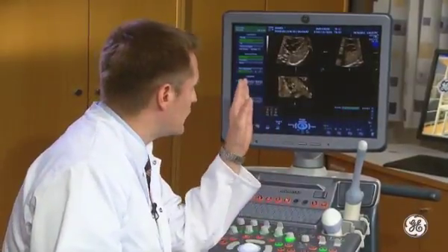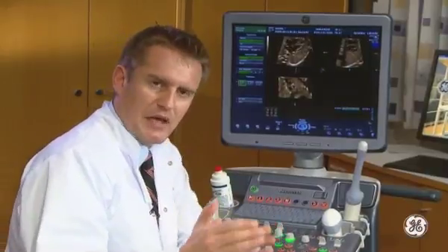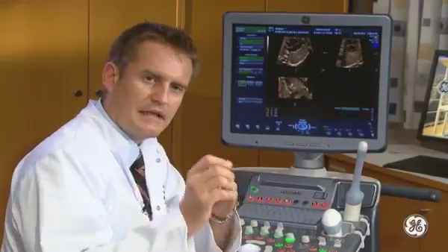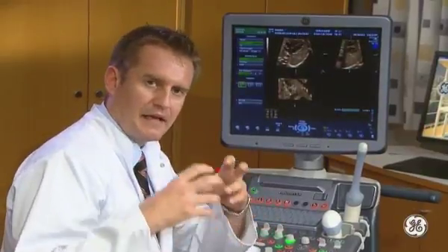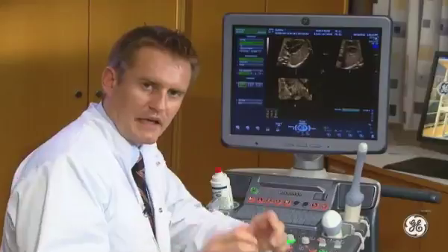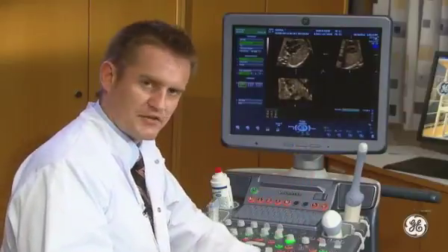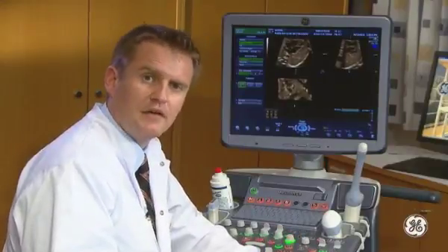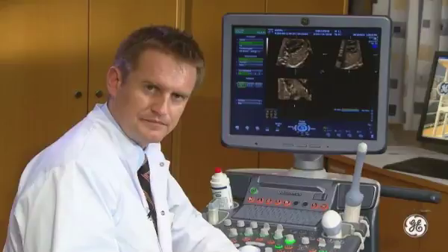Here, for orientation, which is the next step, I will use the descending aorta that will lead me to the alignment of the cardiac anatomy within the chest. Afterwards, I will use several options to demonstrate basic cardiac views.